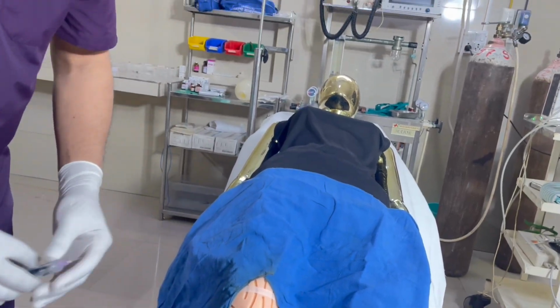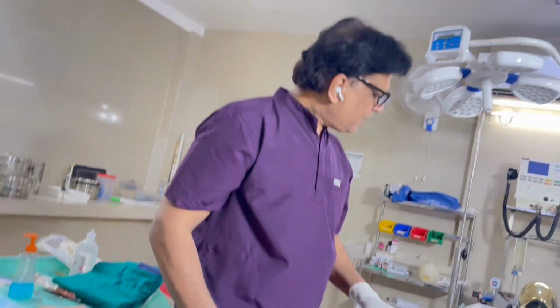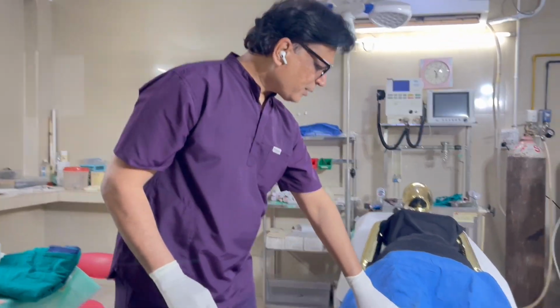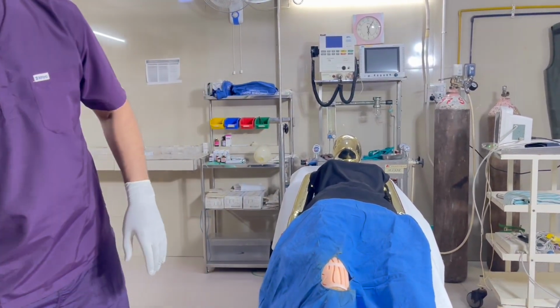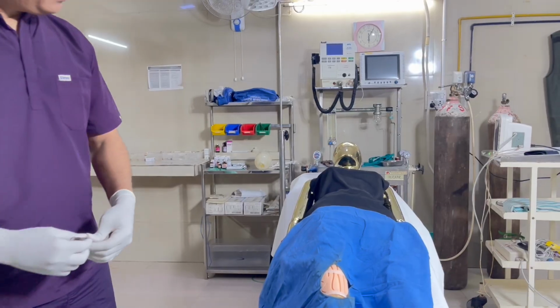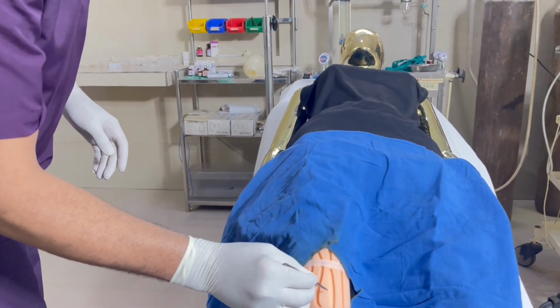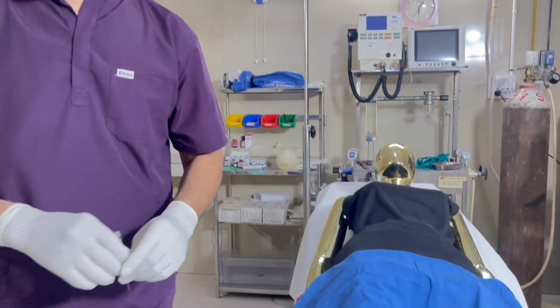So after injecting the local anesthesia, so Miss Linda, I will be just waiting for 2 to 3 minutes. So till that you feel the numb. So after 3 minutes, I will be just checking it. You just tell me, are you getting sensation? No. So okay, thank you.